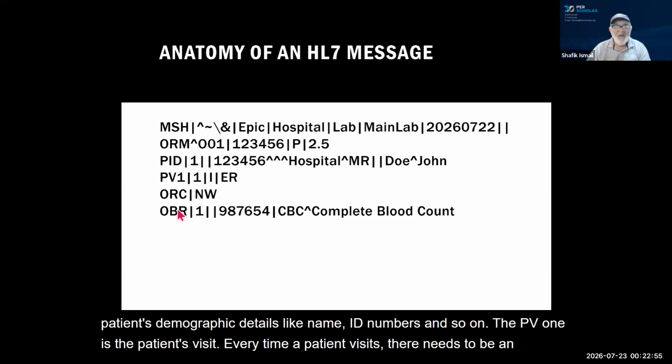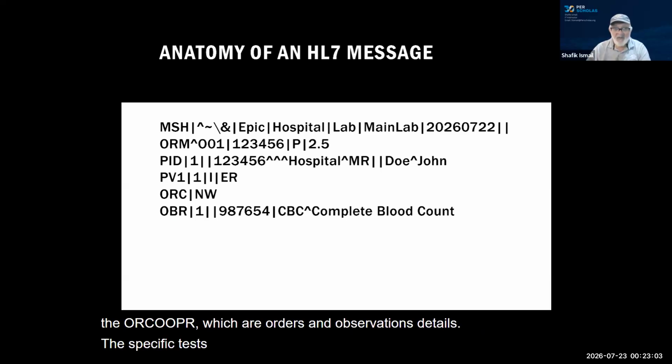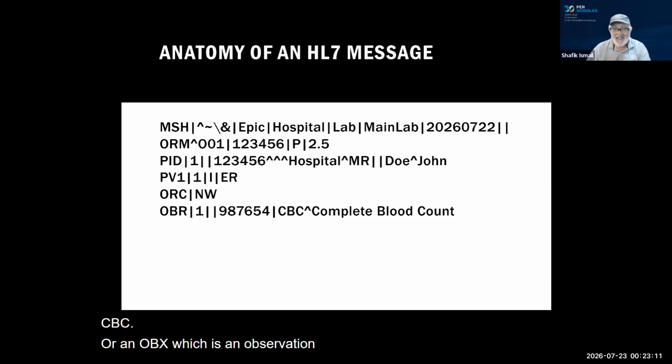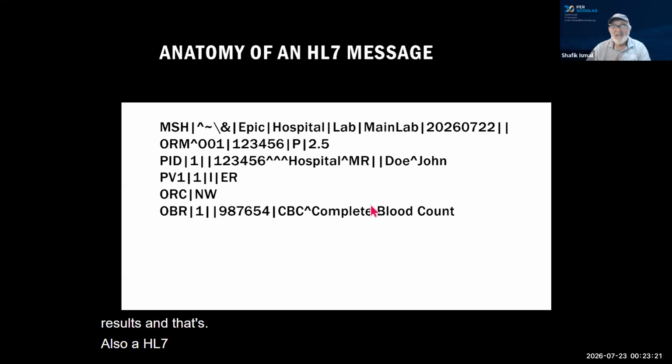The ORC or OBR, which are orders and observations, details the specific test required. For example, a complete blood count, which is a CBC, or an OBX, which is an observation result. It contains the actual clinical test results, and that's also an HL7 transaction. All right, so let's try and break this down.